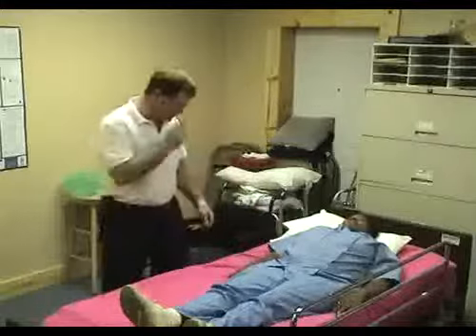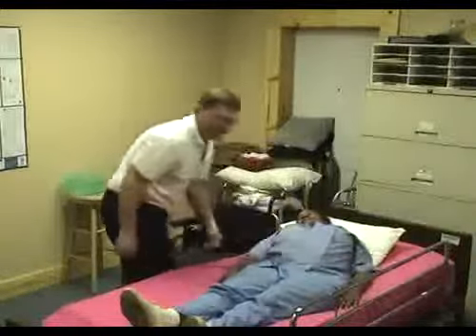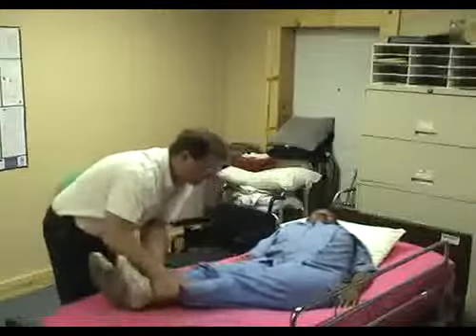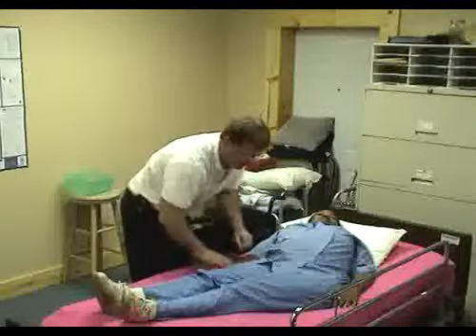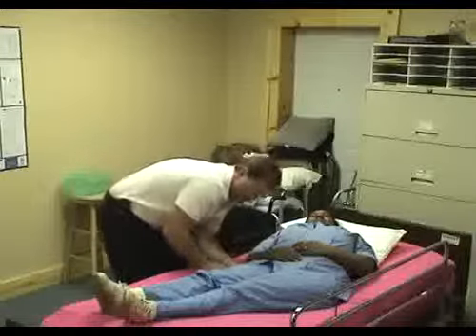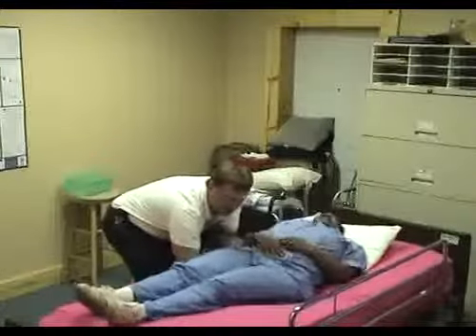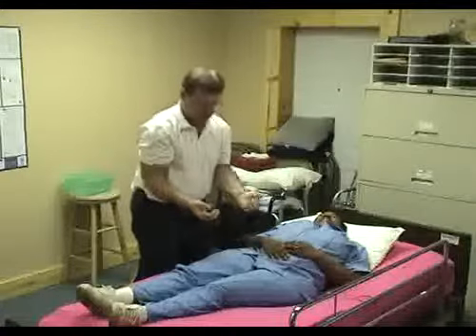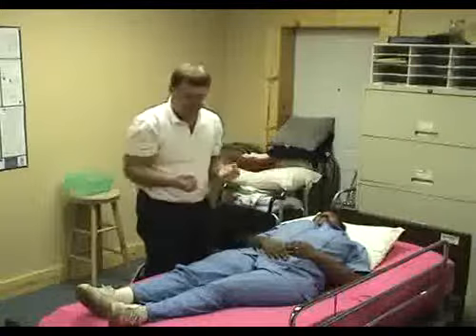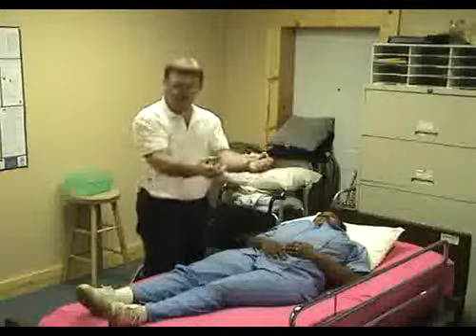So we're going to move her to the side. We're going to bring your shoulders over. I had a couple of patients like this. Bring this over. Would you have a draw sheet under there? You could use a draw sheet. Now, I don't want to rip or tear your clothes, but if you pull it, you can get your hands under and pull towards you. It's much easier than trying to push. You don't want to go on the other side and push. You always want to pull towards you.